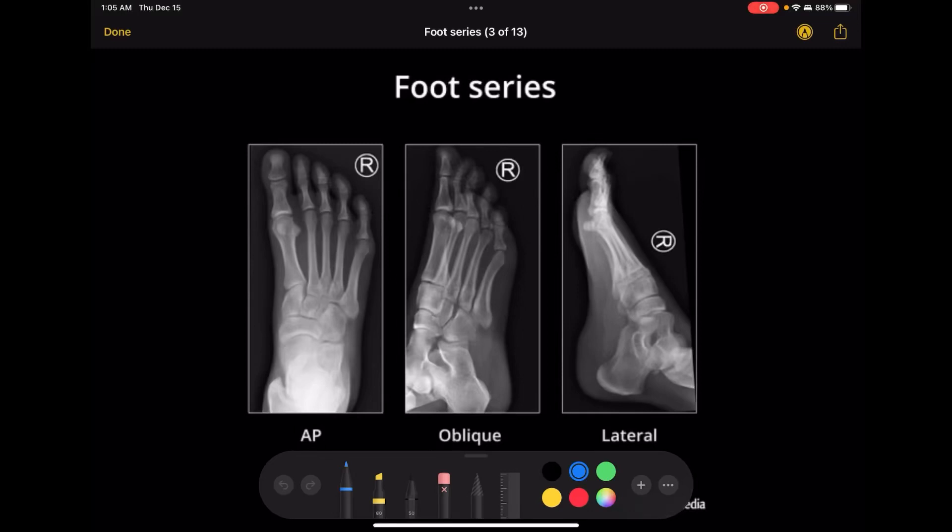Hey guys, this video is going to be an image evaluation of the foot x-rays.